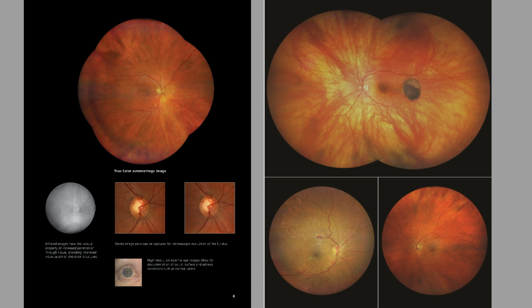Right. Okay, so look, Doctors Adam and Paul, I am that patient that shows up and says, I got to go back to work in 20 minutes, and I can't be dilated. I'm usually returning to the same clinician who didn't find any disease before, and so I pay the extra money to get my ultra wide field image in non-mydriatic capture.